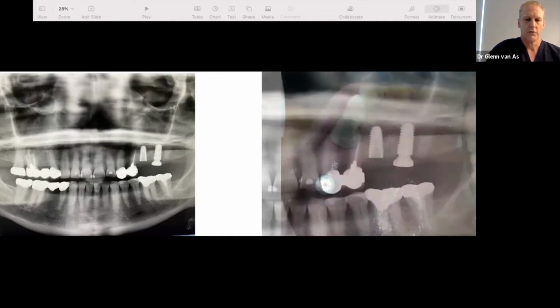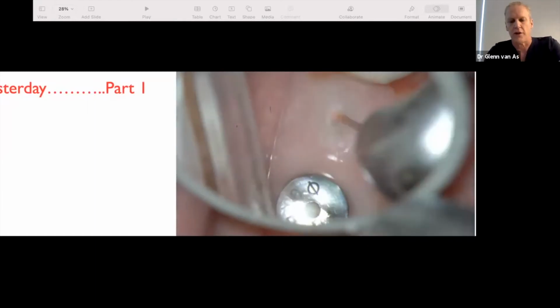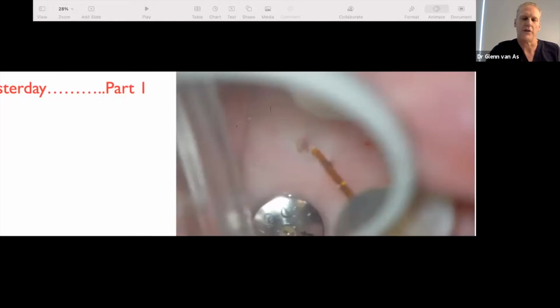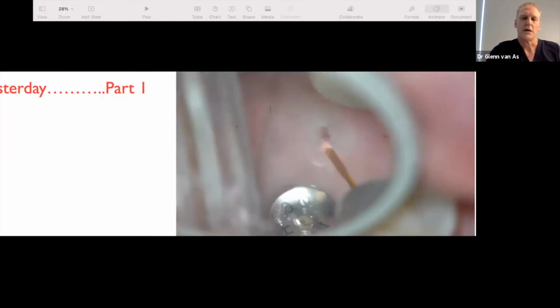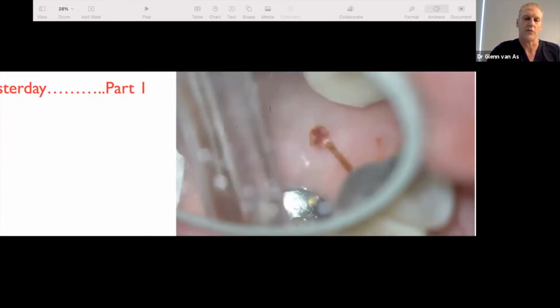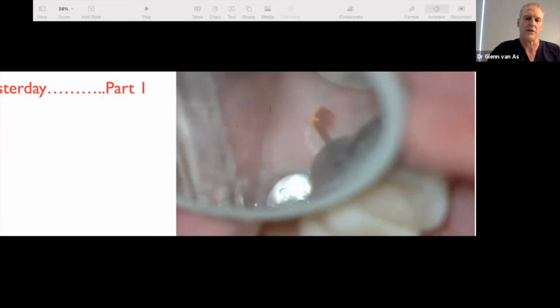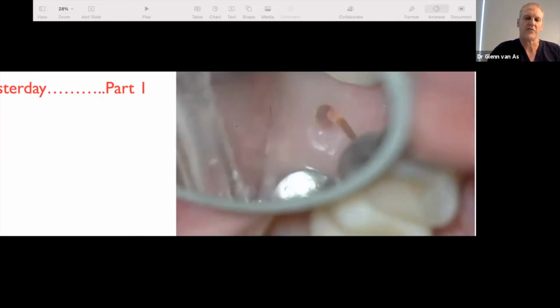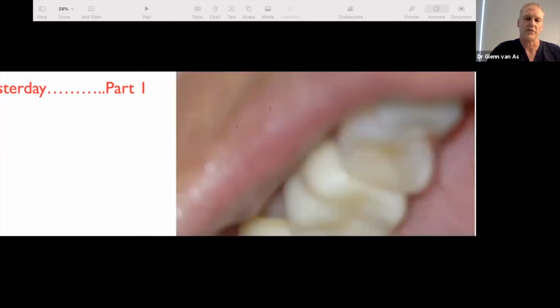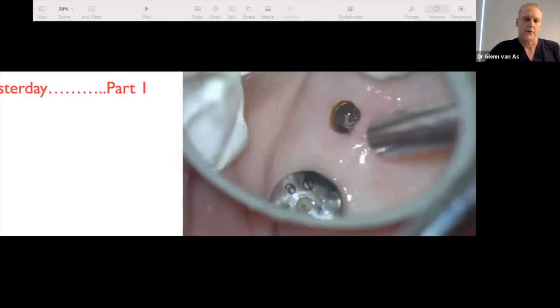It's grown over. So you see here in close-up view, we're able to use a hard tissue laser. This is an erbium hard tissue laser. The video may be a little bit choppy, but it will improve in time here. We're actually able to uncover the implant here and use the laser in real time with water. And one of the things, compared to a burr or compared to a tissue punch, is you really have a clean field to watch. And the fine spray really takes the blood and distributes it. And there's a little bit of cauterizing going on. There's a little bit of blood there, and I'm able to remove the tissue and get right back down to the shoulder of the implant.